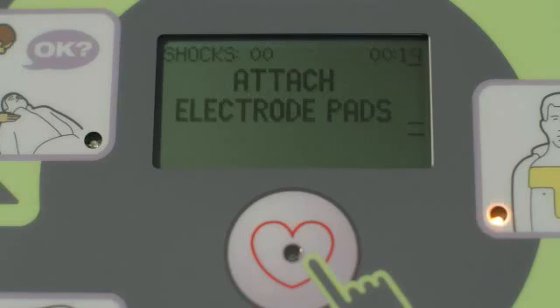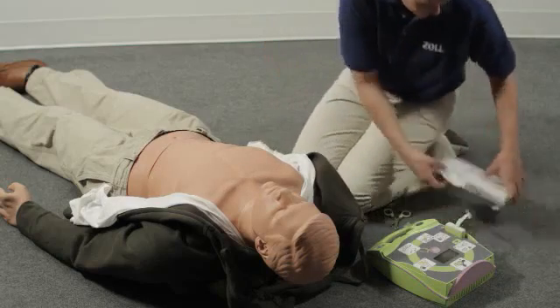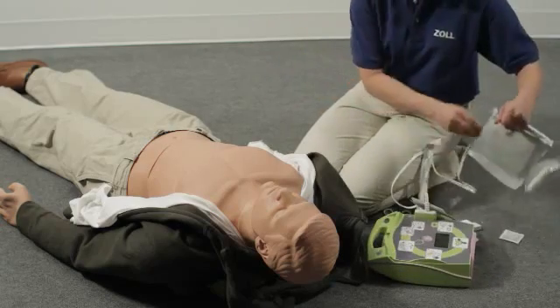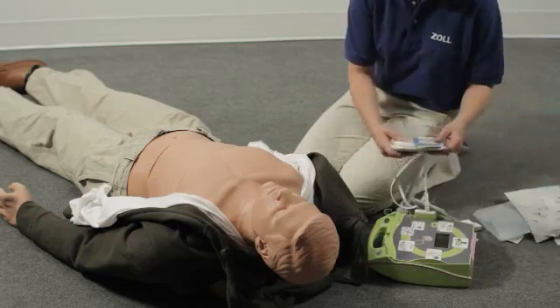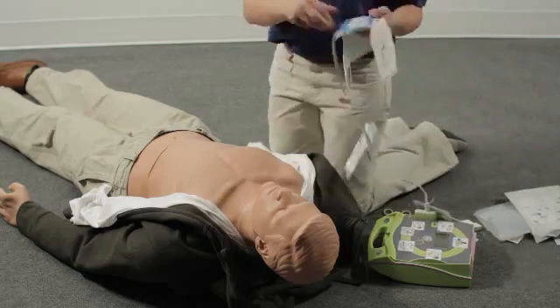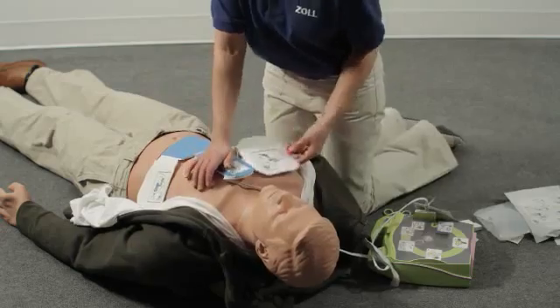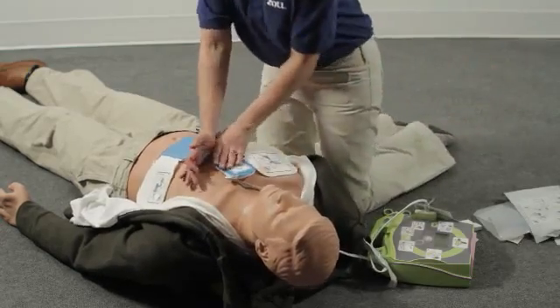Attach defib pads to patient's bare chest. Dry the chest if necessary and quickly shave it if there is heavy chest hair. Attach defib pads to patient's bare chest.